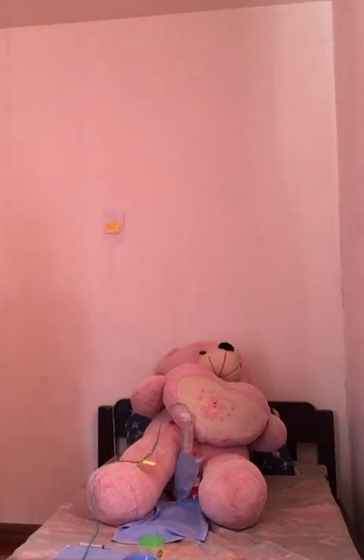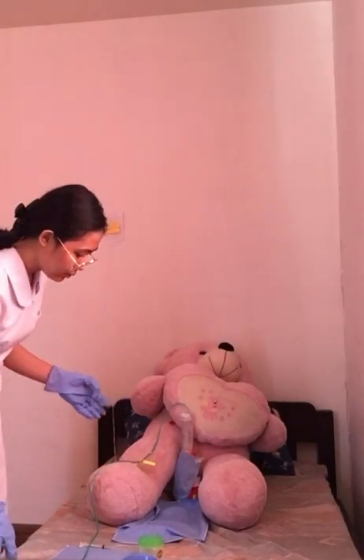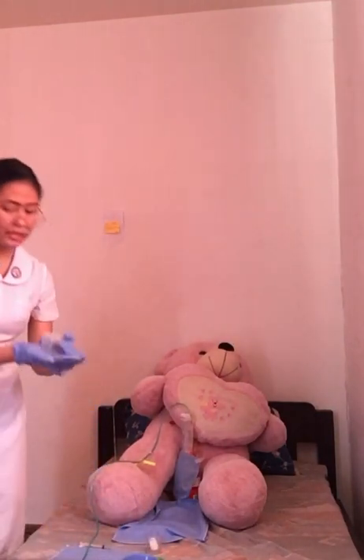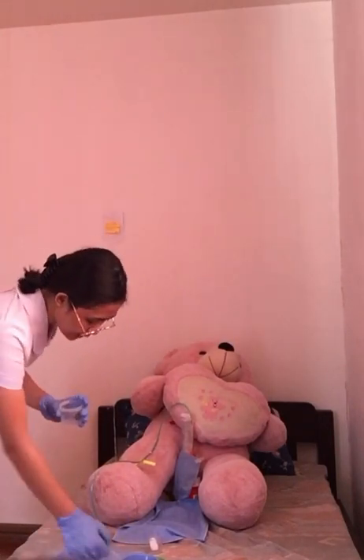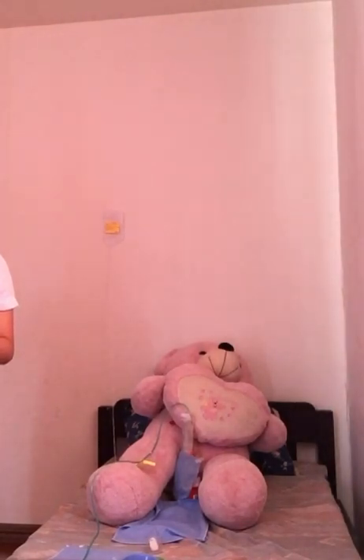And next, we need to open the supplies using aseptic technique, and then aspirate the prescribed amount of the irrigant. So we will be putting our solution into our sterile container, and we need to aspirate the prescribed amount of our irrigant. Our syringe is 30 to 60 ml, so we will aspirate our irrigant solution.